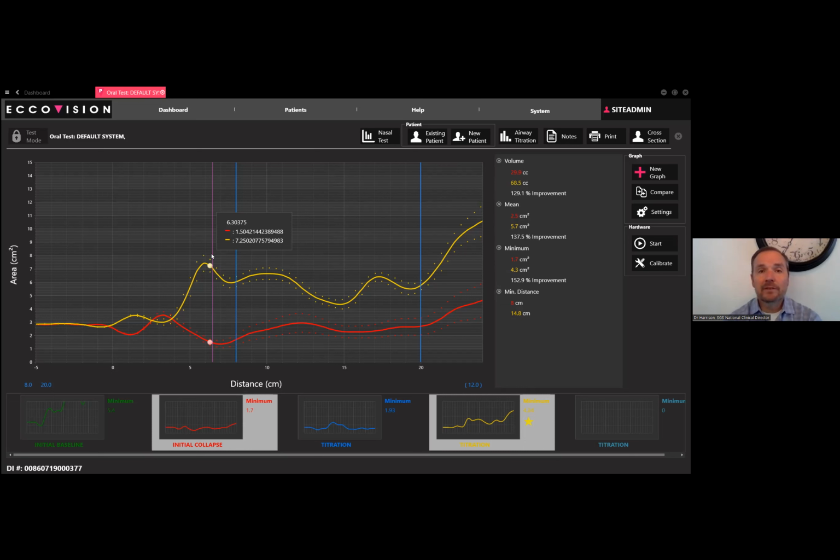We also have to be aware that there's no active undiagnosed TM problems, because that will make sleep very erratic. So always triage pain first. Decompressing jaws doesn't take very long to do. And for those patients, you don't want to activate muscles that are going to be angry, because the muscles will always win. But in a patient that's asymptomatic and doesn't have an issue, sometimes a little bit more vertical makes all the difference. Now, sometimes it doesn't, but isn't that valuable information that you want to know before you take an impression, before you take $1 from that patient?